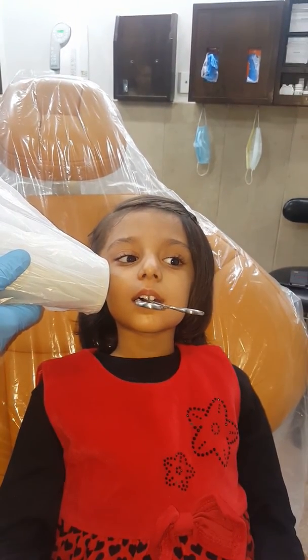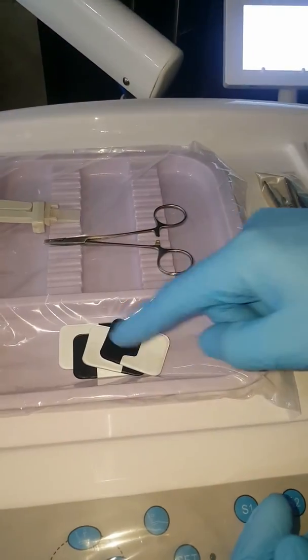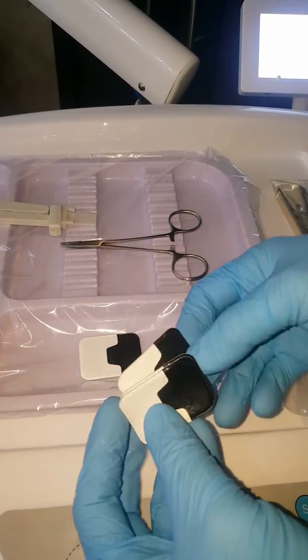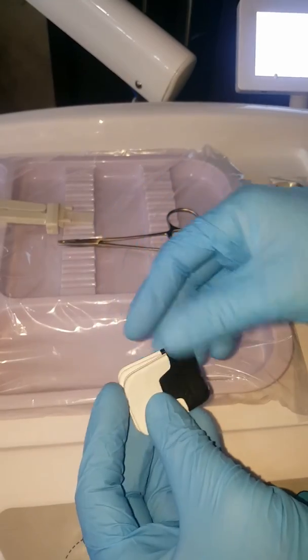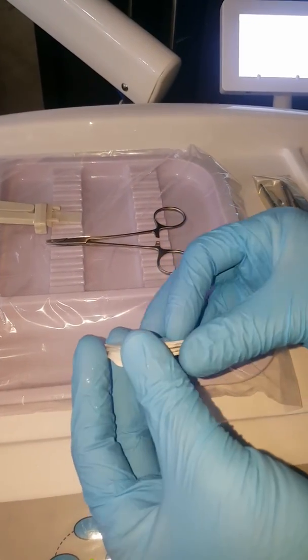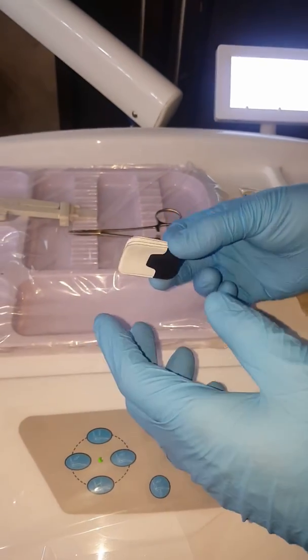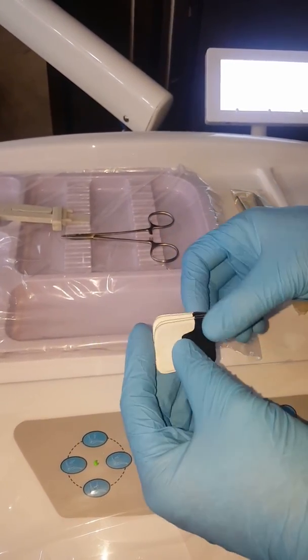So you see, now the films are exposed. What we'll do is align them and take them upstairs to develop. Then we'll look at how the images come out, and that would give you a good exploratory view of the child. In case you need to take periapicals afterwards, you can always do so.